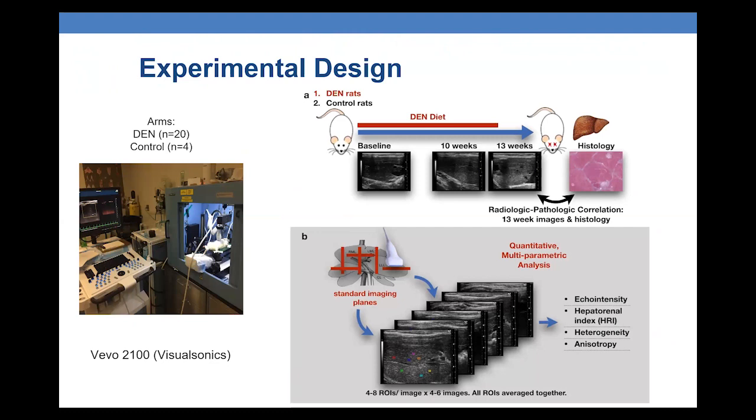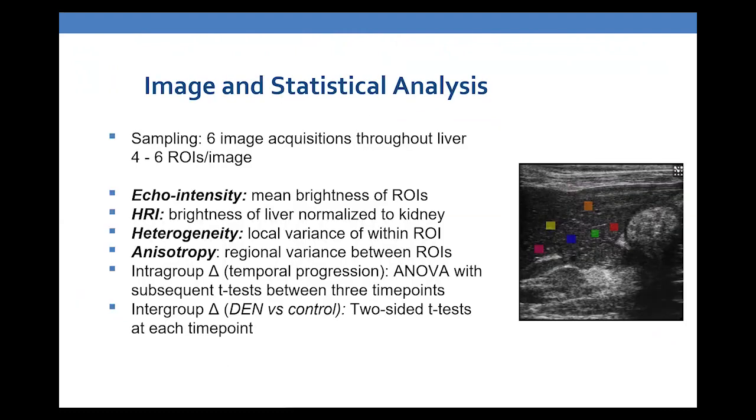Okay. I was looking at that slide. So the areas that you choose, I've seen other techniques where they'll use another tissue as kind of a control, like using the kidney or something like that. Have you done anything like that?